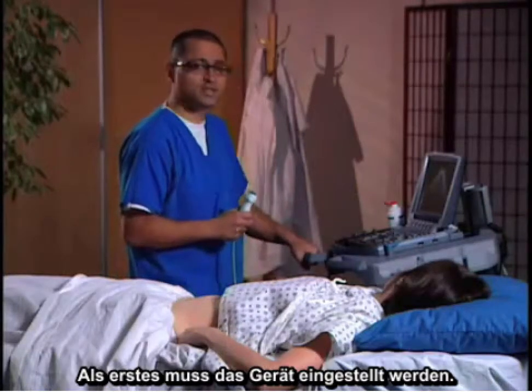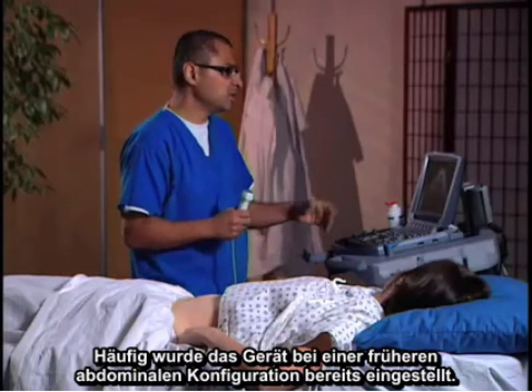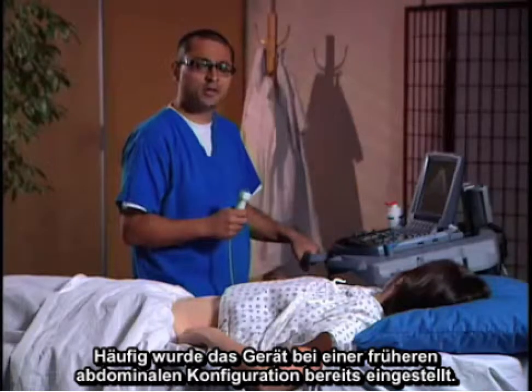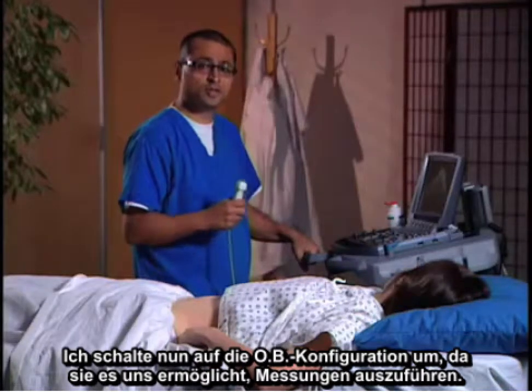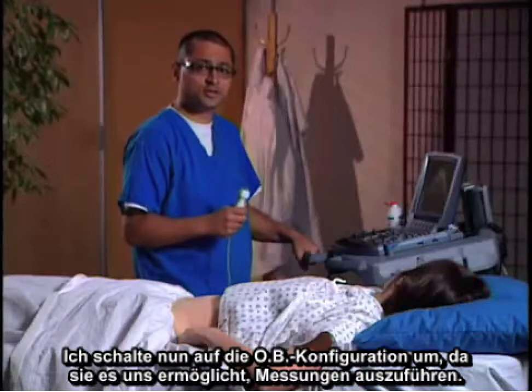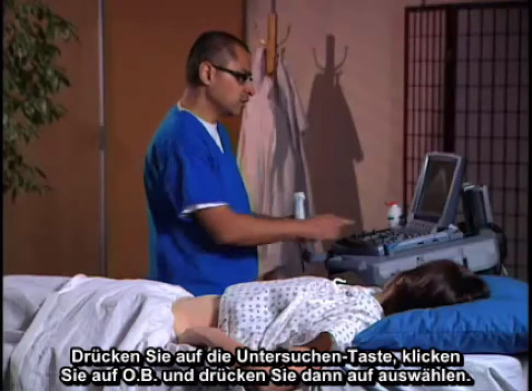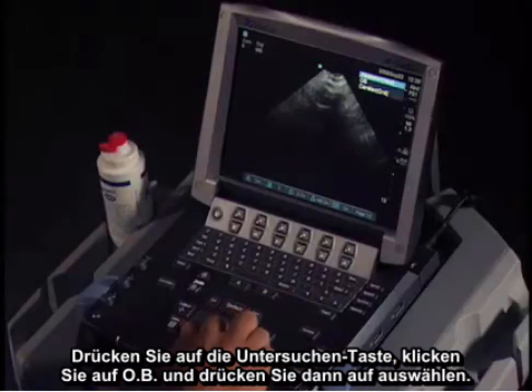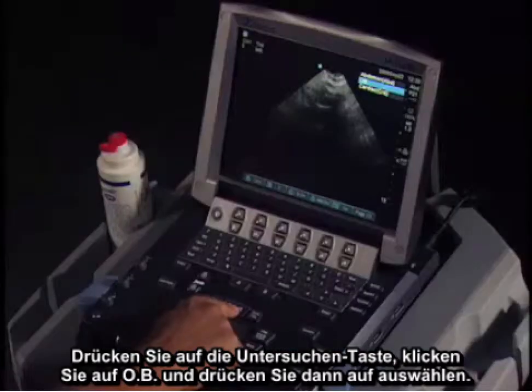First, machine setup. The machine may have already been set up in an abdominal configuration. I'm going to switch to the OB configuration because it allows us to do measurements as well. I'll hit the exam key, click on OB, and then hit select.